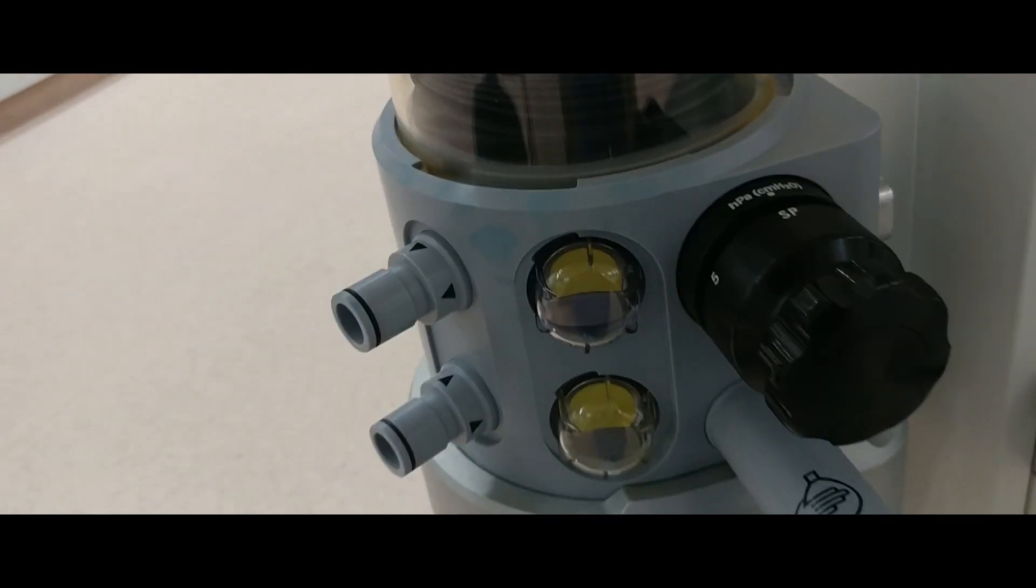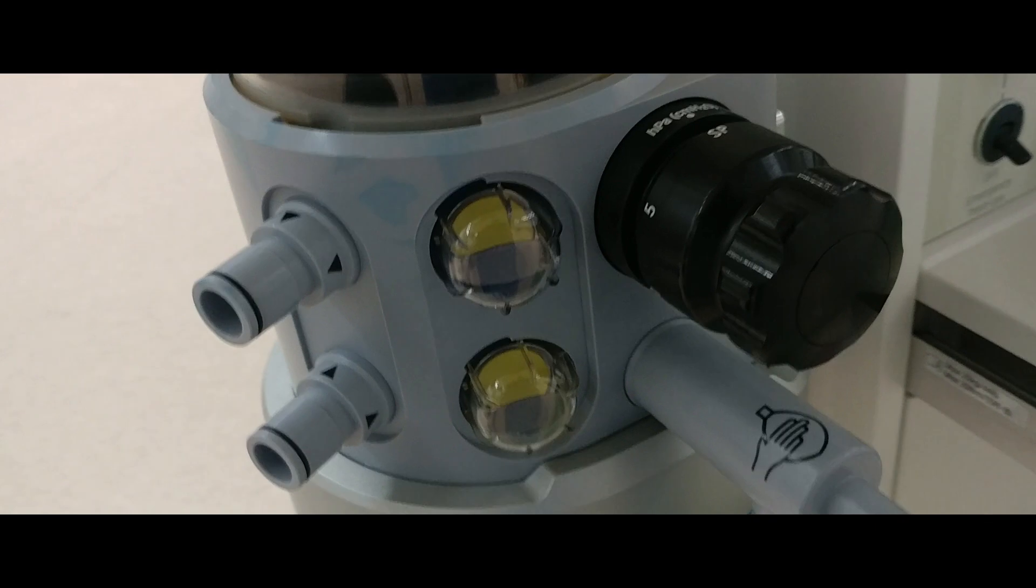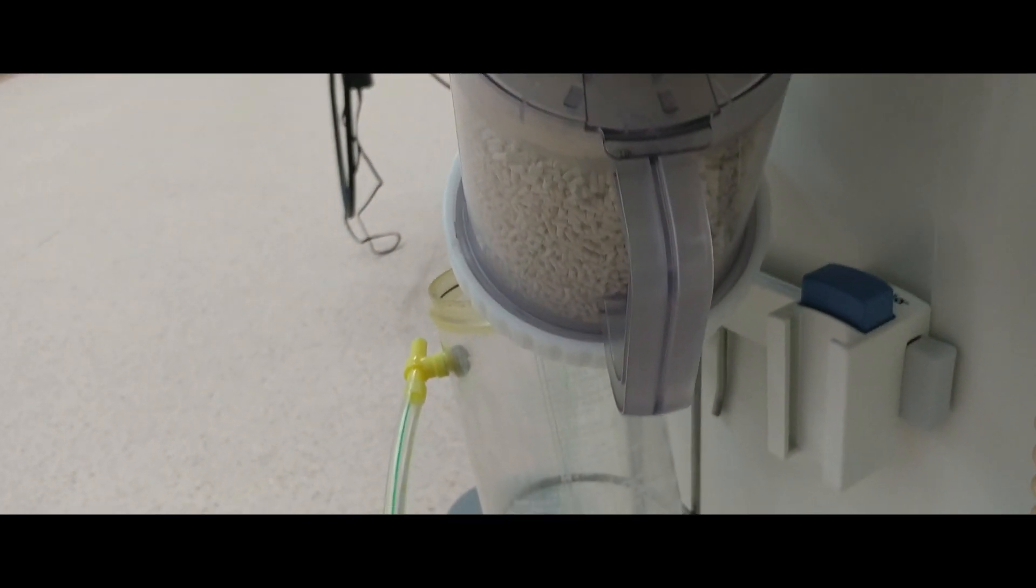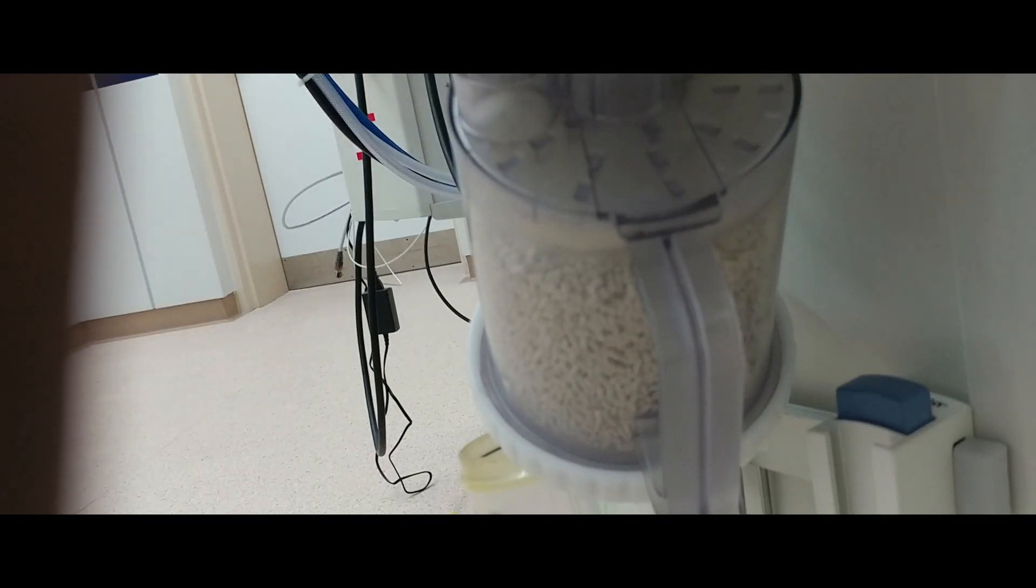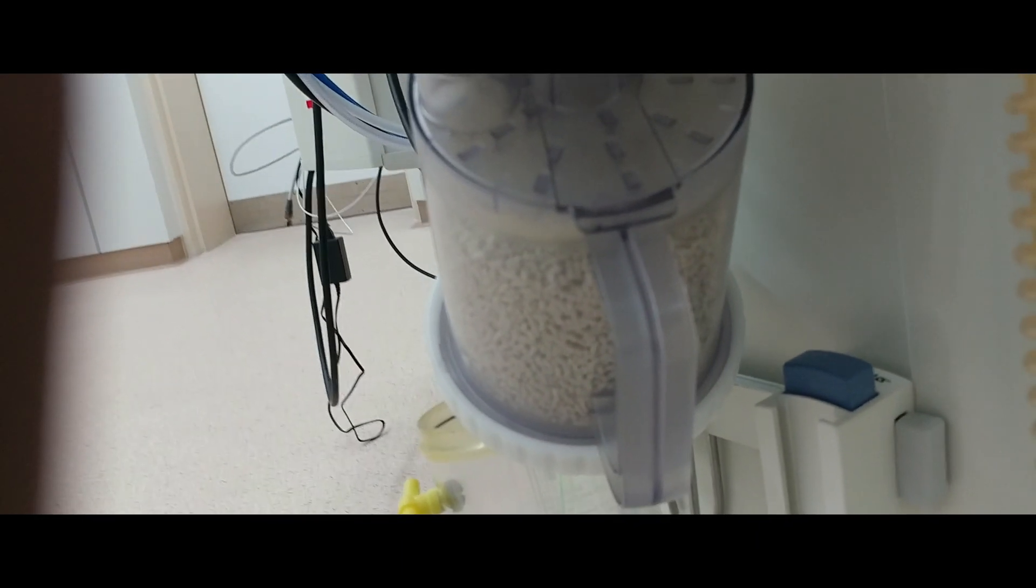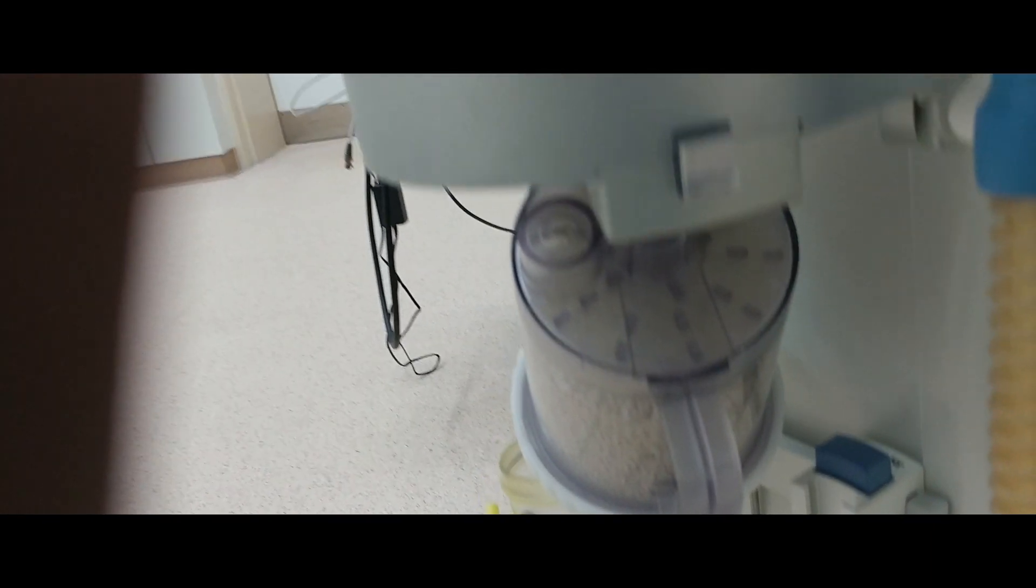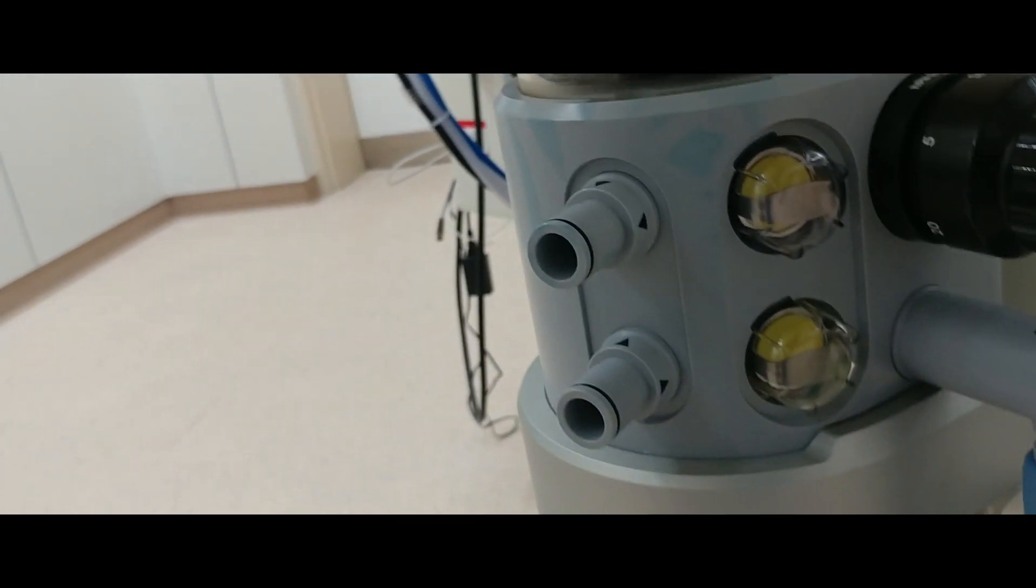At a pressure above the opening pressure of the valve, a controlled leak of gas is allowed from the system, which enables control of the patient's airway pressure. The minimum pressure required to open the valve is 1 cm H2O. A safety mechanism exists to prevent pressure from exceeding 60 cm H2O.